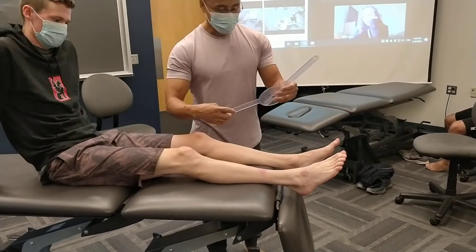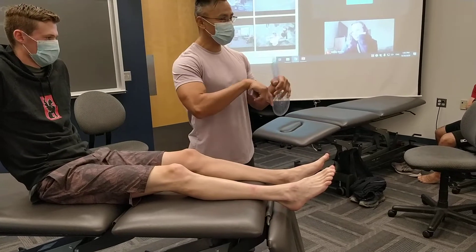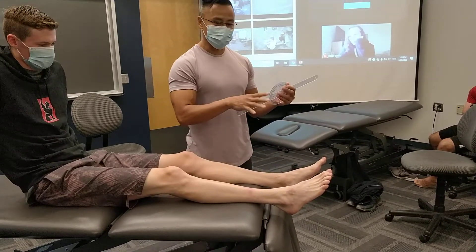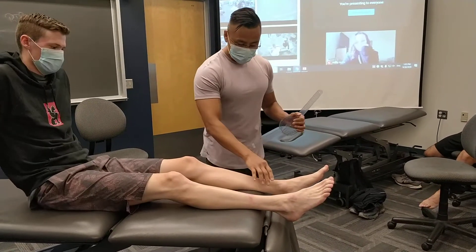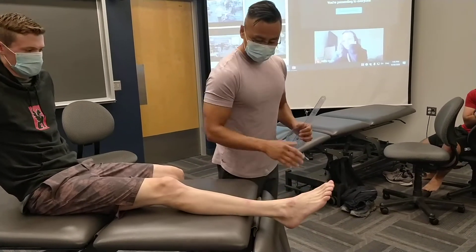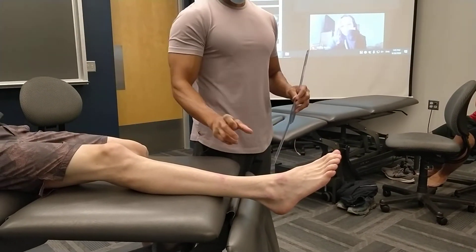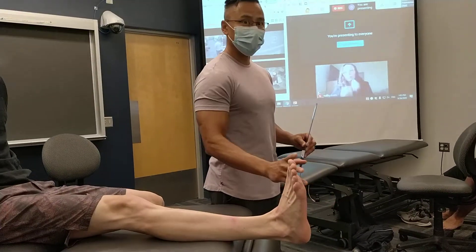It does, but it doesn't matter. If you want the numbers right side up facing you, that's okay. But as long as you know what the starting and ending angles are, that's okay. Let's kick this guy aside. So that's resting position. The zero is hypothetically perpendicular.